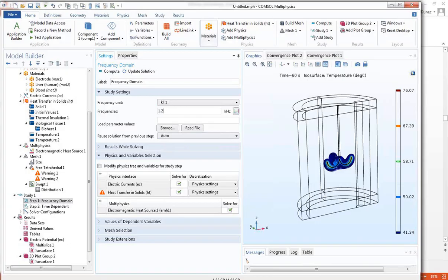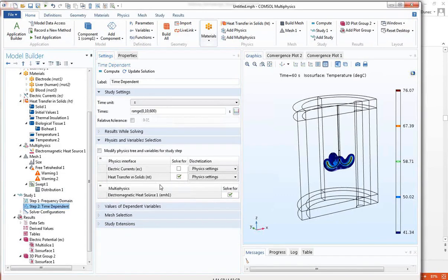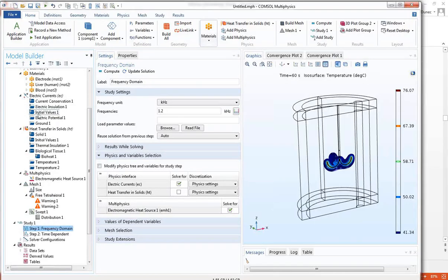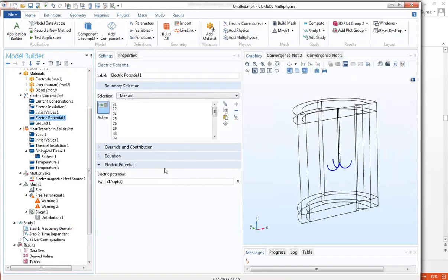Now, remember, we had that RMS, so I want to change that. We're not doing this in heat transfer, since we're doing the time dependent only for heat transfer. We're doing the frequency domain for electric currents. That's right. I'm going to go back up to my electrical. Now I can really use peak to peak, so let's get rid of this square root of 2 stuff. And we're done.